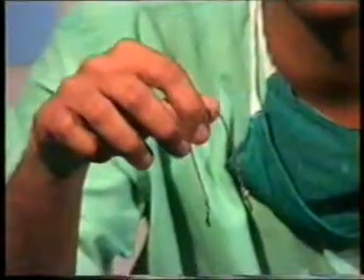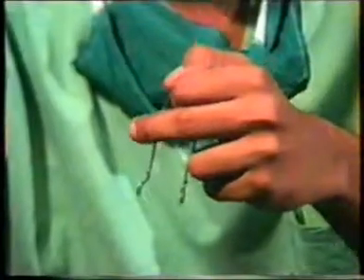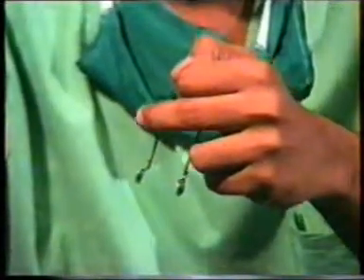For examination of the nose in ENT, the nasal examination is done with an instrument which is called the Thudichum's nasal speculum, held in the left hand with the middle finger and ring finger on either side. The instrument is gradually closed, and as we open the instrument we can visualize the floor of the nose, the nasal septum, the inferior turbinate, the middle turbinate. This instrument is also used in the operation theatre for various nasal surgical procedures.